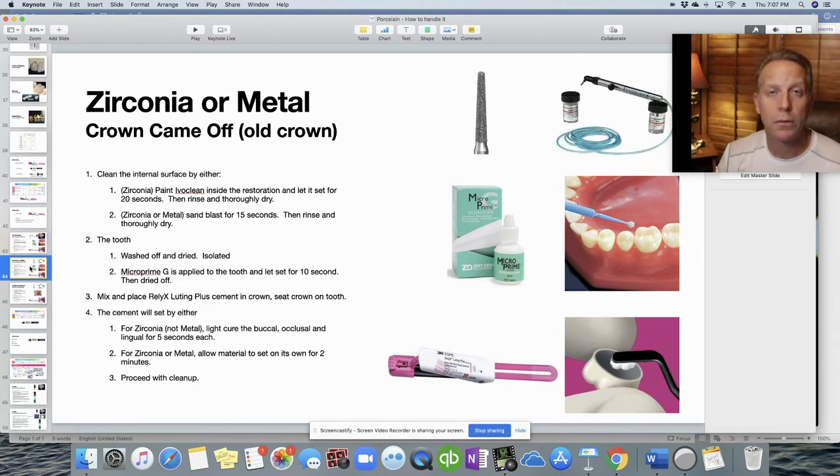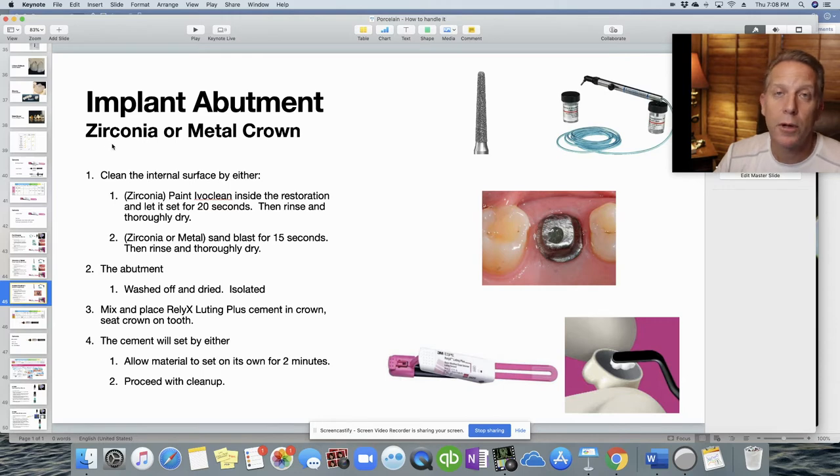For a zirconia or metal crown that's come off — an old crown the patient has been wearing for years — clean out all the cement from the tooth and from the internal surface of the restoration. Then prepare it similarly to a new crown: paint or sandblast the internal surface, and move through the other steps. For implant abutments, clean the internal surface of the restoration, clean and dry the abutment, isolate, place Teflon inside the access hole to prevent cement from fouling the access screw, then mix and seat the cement.